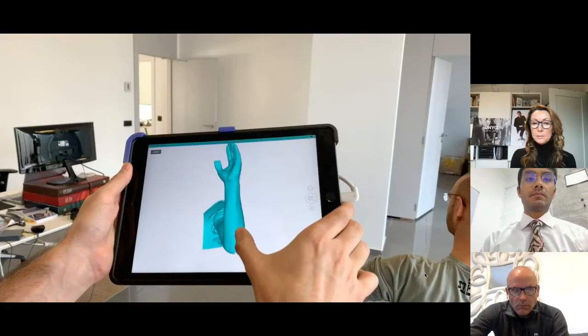And like you see, we are able to make super fast scanning. Like this scanner maybe takes 7 seconds, something like that. A leg, maybe you can take 10, 12 seconds of scanning. And this will be the first process.